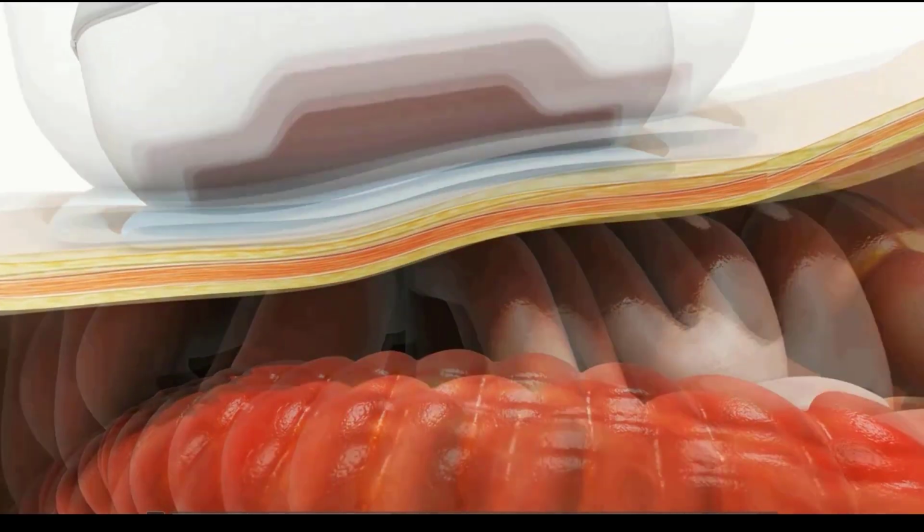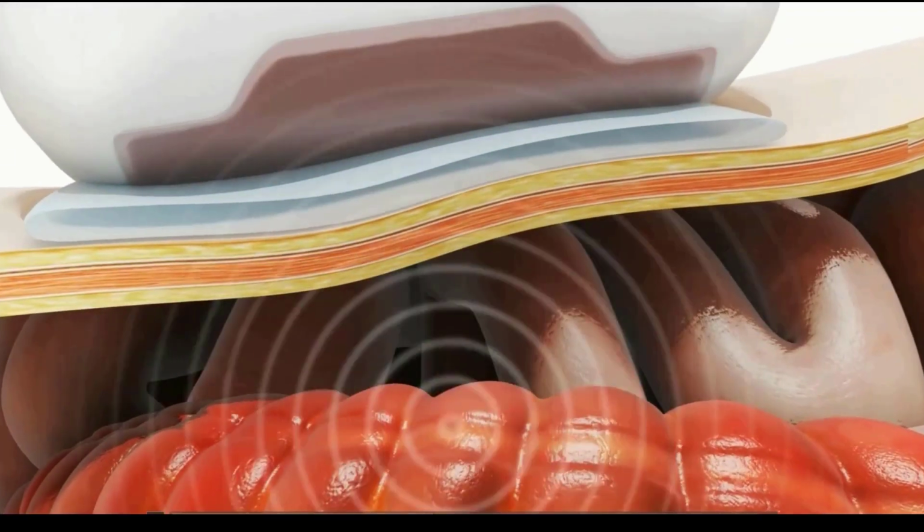And then what happens is the molecules become excited. And this is a very common phenomenon that people understand from optical imaging. And the exact same thing happens here. The molecules go from a ground state to an excited state. In the case of traditional optical imaging, where you have optical excitation and optical detection, then you're detecting a photon that's emitted. We don't see those photons, so as long as something absorbs light, whether or not it emits a photon or not, that we don't see or really care about too much.